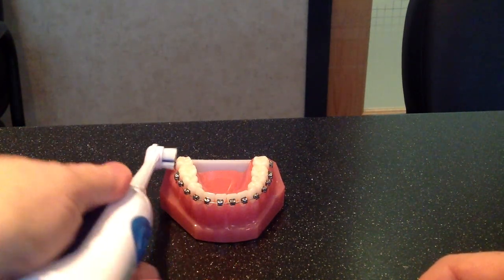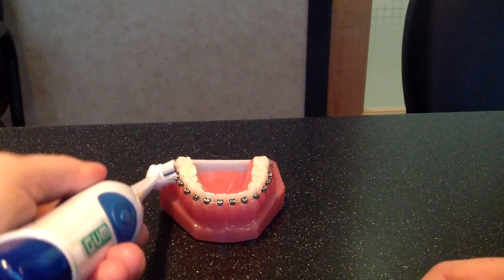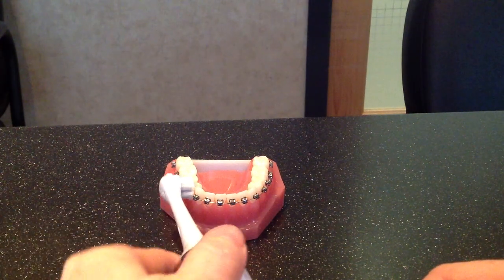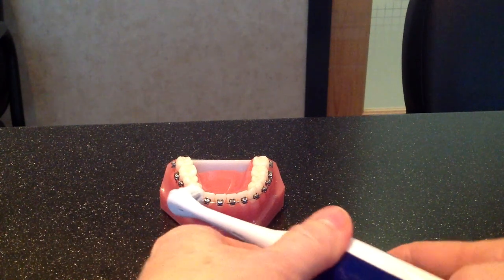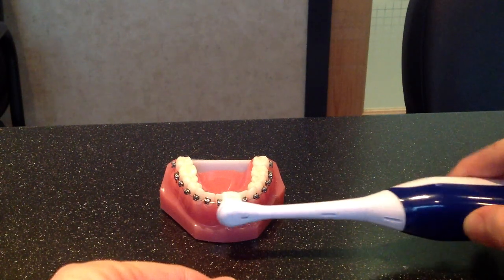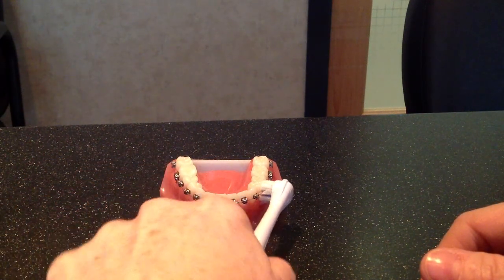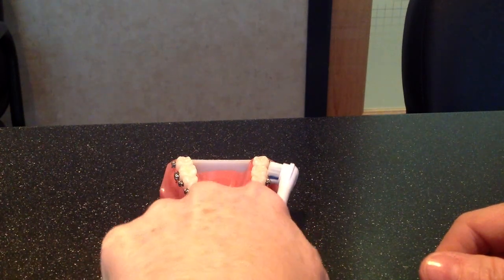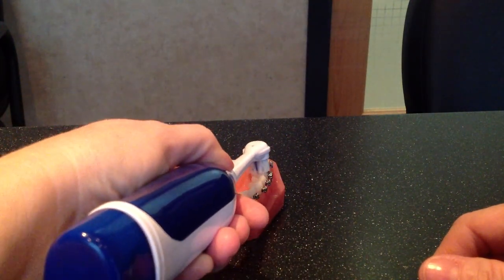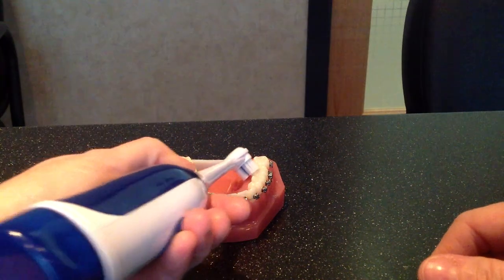Three or four passes along each tooth. You can see how the bristles get right up underneath and get in there and move around. You might find that you still need to go around with your little tiny proxy brush to get out small pieces that are stuck in there, but the rotary brush does a really nice job. Just concentrate on each tooth, three or four passes all the way along. And don't forget the insides and the tops where you chew — go all the way along, then across the tops, the insides, and the chewing surfaces as well.